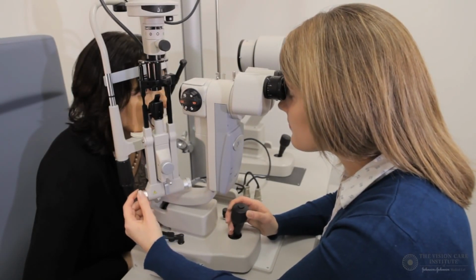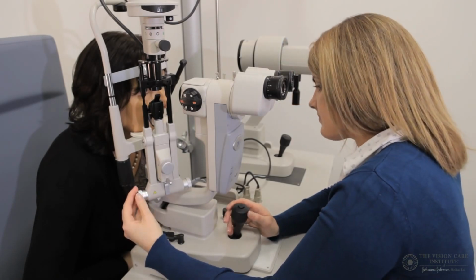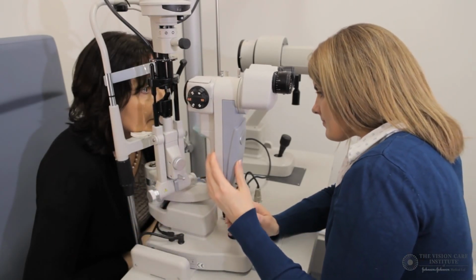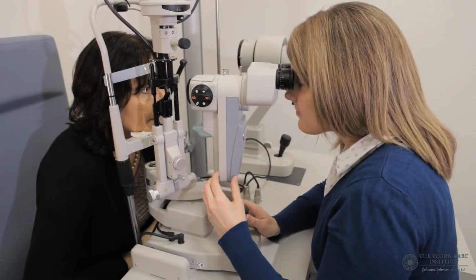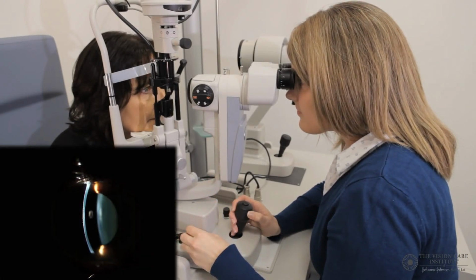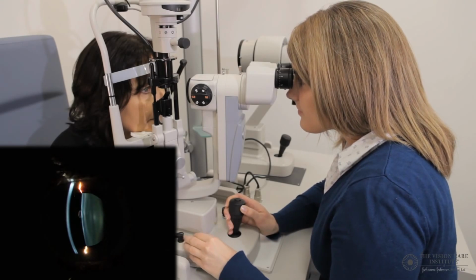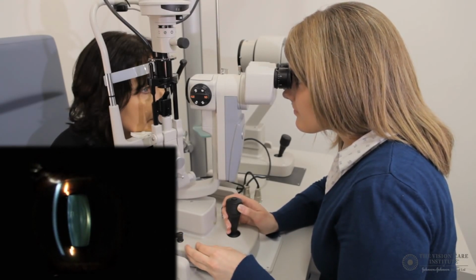In order to conduct this technique, the first thing we do is to have a clear section of the cornea whilst having an angle between the observation and illumination system of about 15 degrees either side of the midline. Once we have this, and we have a clear section of the cornea, we push the slit lamp forward until we generate a clear section of the anterior part of the lens, as seen here, and then continue to push the slit lamp forward until the posterior part of the lens comes into focus, as we have now.